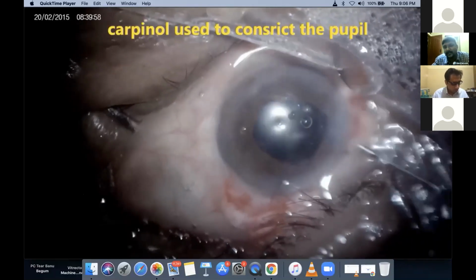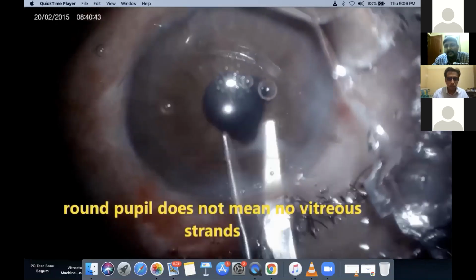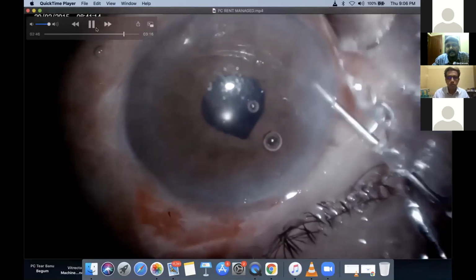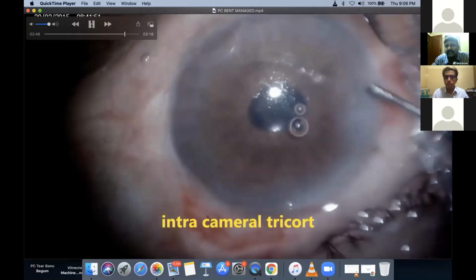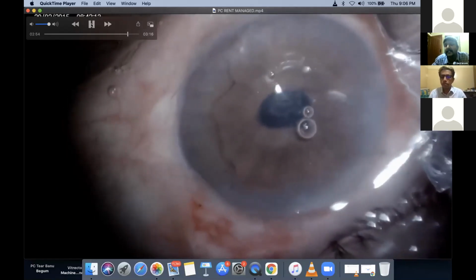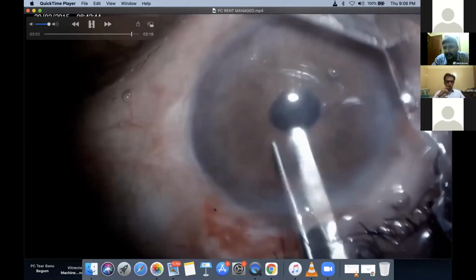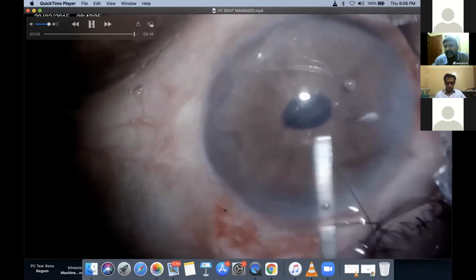The carbachol was used to make sure that the vitreous is not there, but yes, there was vitreous there. So again we continued with the anterior vitrectomy. And finally, intracameral triamcinolone was used to confirm that there is no vitreous there. A round pupil does not mean that there is no vitreous in the anterior chamber. I could see that there was a strand going towards the side port, and then I cut whatever vitreous was there in the side port, and then the AC was formed.